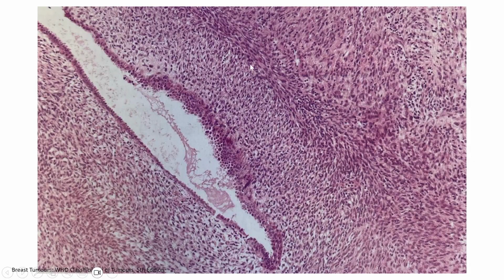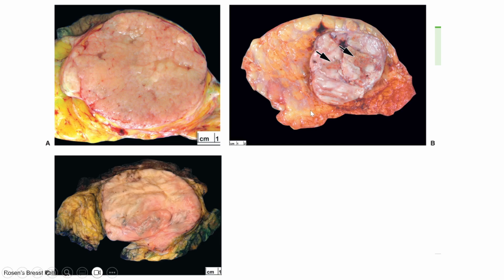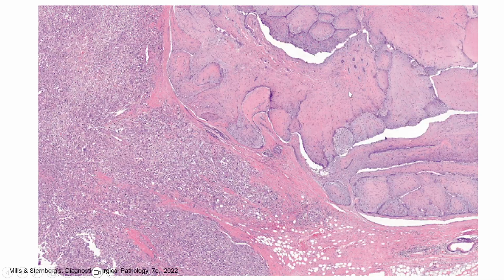And then if you see the stroma like this, really hypercellular, tons of cells, and the cells also show a little bit of atypia, and the growth pattern is almost forming this herringbone pattern like sarcoma, we can call this borderline phyllodes tumor. Here I also would like to show you, you can see this infiltrated growth, also another feature for borderline phyllodes. And then this one is relatively well demarcated from the gross image, you just could not tell whether it is infiltrated.